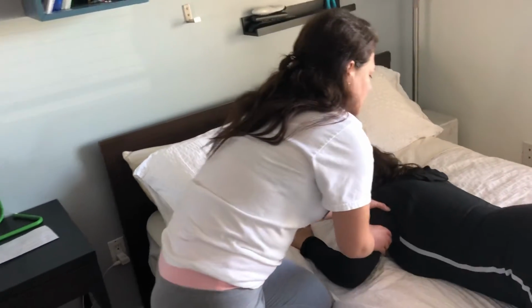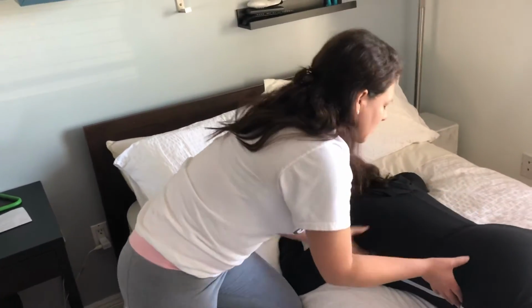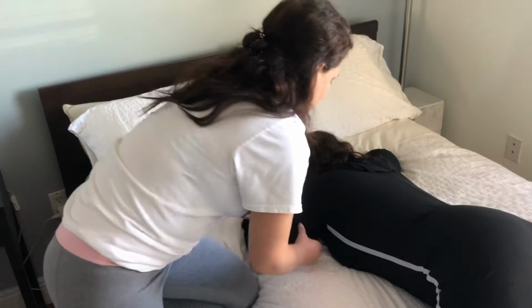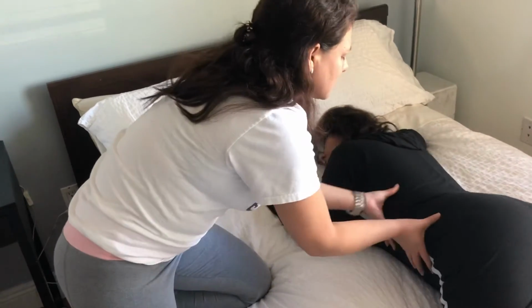I have to make sure that she's straight. So can you bring your body a little? There you go. Perfect. I need you straight with a 35 to 45 obliquity. That should be enough. Okay, elevate this a little bit more. There. Okay. Okay, there you go.